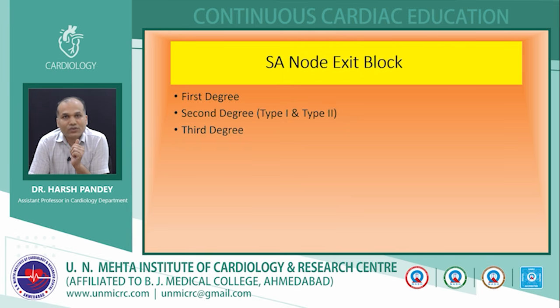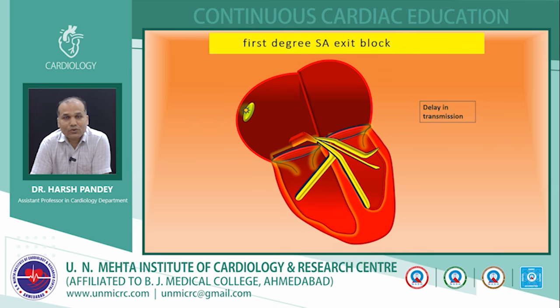Coming to sinus nodal exit block, there are three types: first degree, second degree, and third degree. The second degree has two types, type 1 and type 2. We'll go one by one.